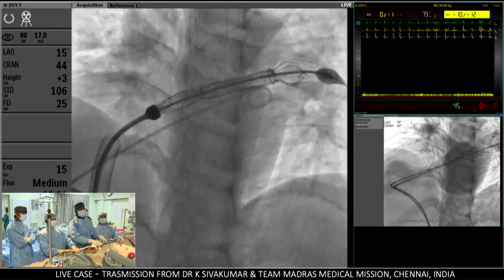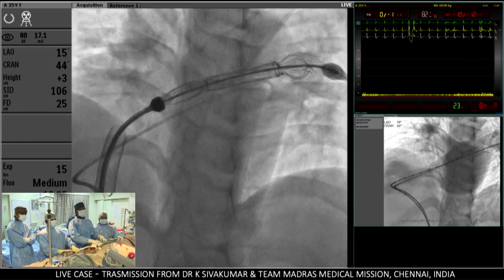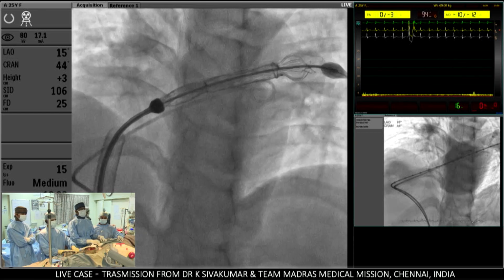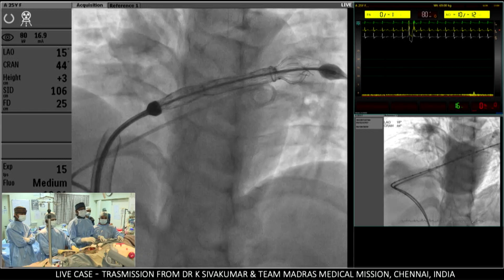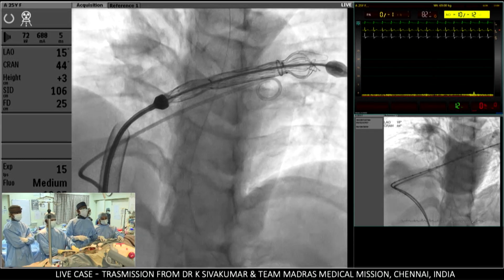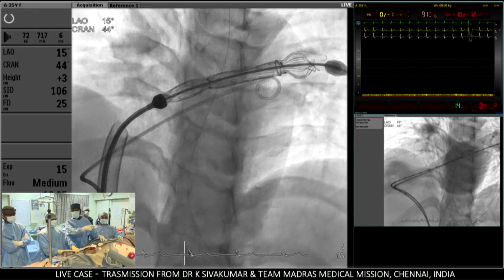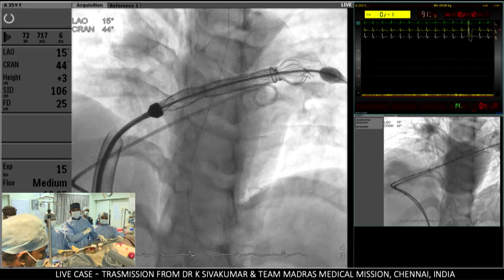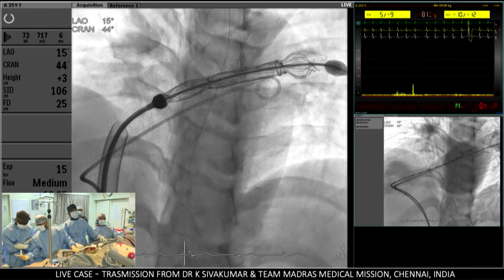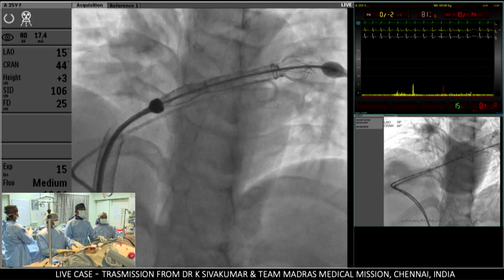That means probably this is not the native, this is not the post-repair, so that's why it doesn't expand too much, maybe because the ring is a bit more rigid. So you go for 36, right? Yeah, the balloon 36 sizing should be okay. The balloon stretched diameter was 32 to 33.